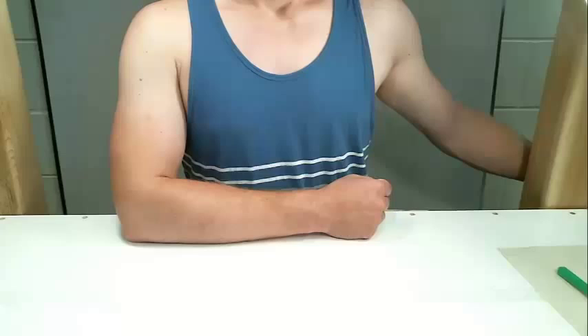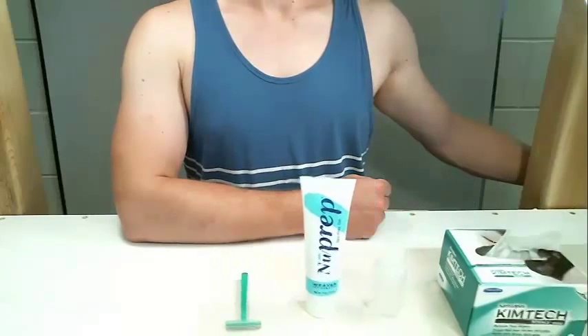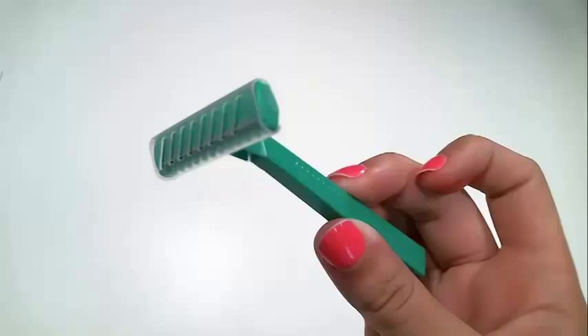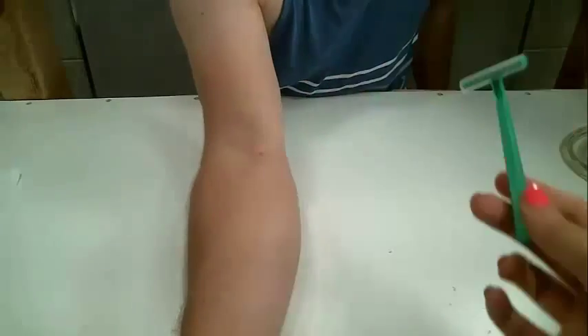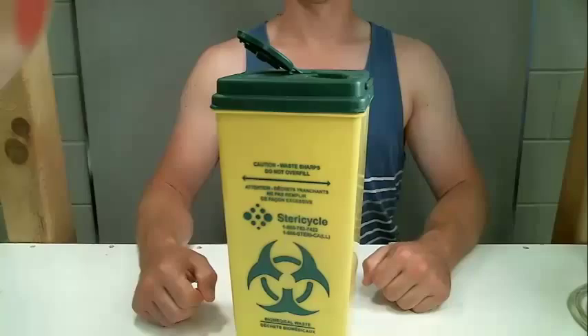Next, you must clean the skin on the surface of the desired muscle. This step is important to lower impedances. An impedance is the resistance of an electrical signal. Impedance lowers the quality of the signal, and therefore lab technicians must take precautions to reduce it. If the area is particularly hairy, a razor can be used to remove the hair. Lightly shave the hair on the skin in the direction that the hair grows. Dispose of the razor in the appropriate biohazard garbage bin.